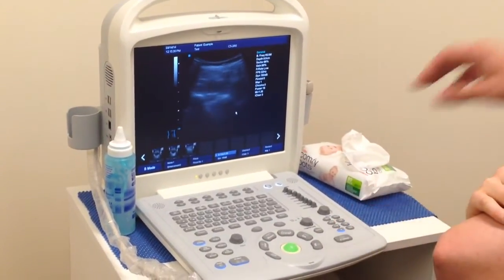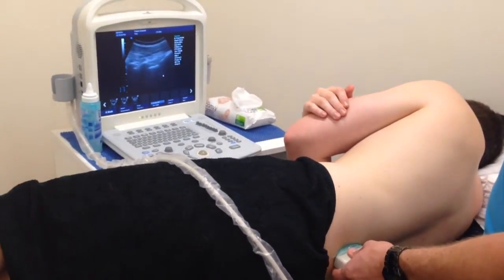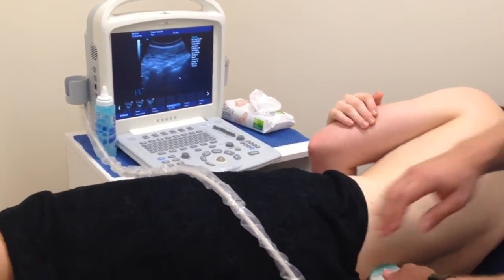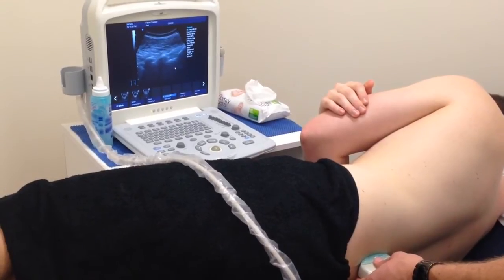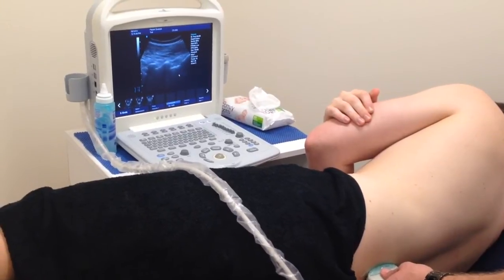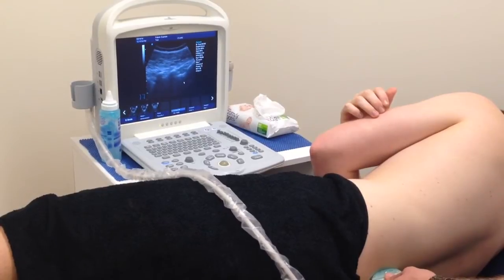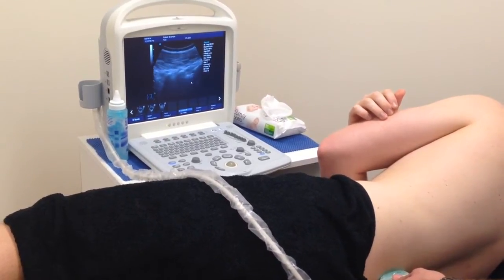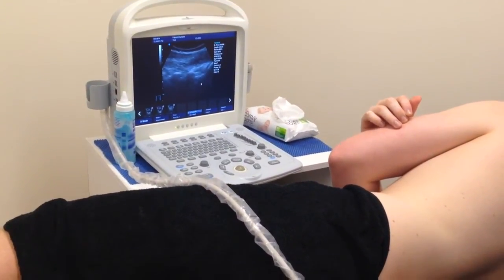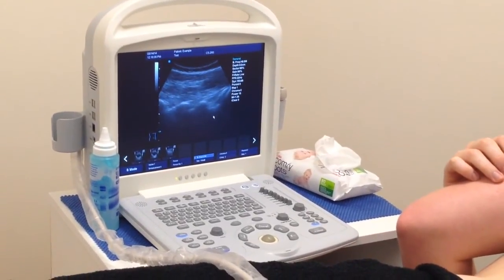and we'll go and have a look and see if we can get Ben to do a contraction of the Multifidus and hold it. So, could I get you to just imagine like you're tilting your pelvis back towards us, and relax, and one more time. Now we're not getting it, backwards, sorry. Yeah, and relax again. Yeah, so there we see the contraction, just relax there. Okay. So again, I'll get you to turn on that Multifidus just by tilting your pelvis. Great. And you can see the muscles swell right up there.